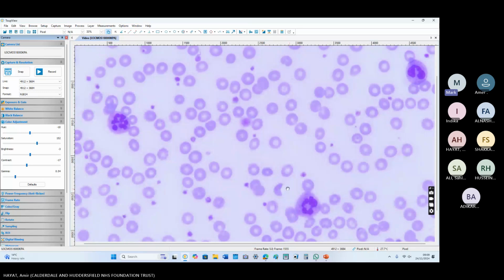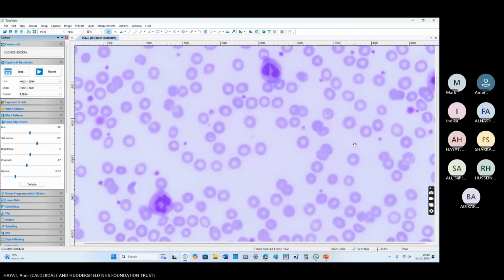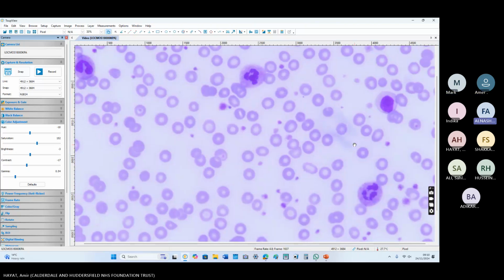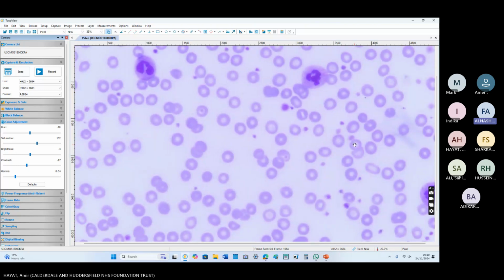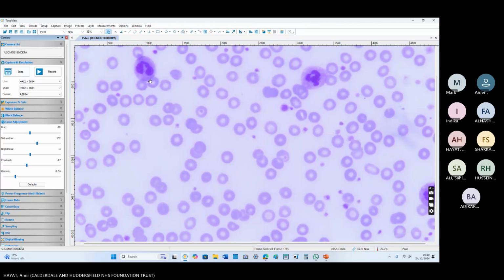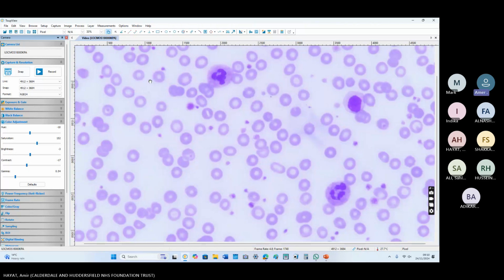What's his B12 and folate? B12 was normal, but the folate was low, 3. Less than 4 is low in our country. This neutrophil is bilobed, maybe dysplastic, this one. The connecting nuclear material is not very thin, but you do see some dysplastic neutrophils in sepsis as well.